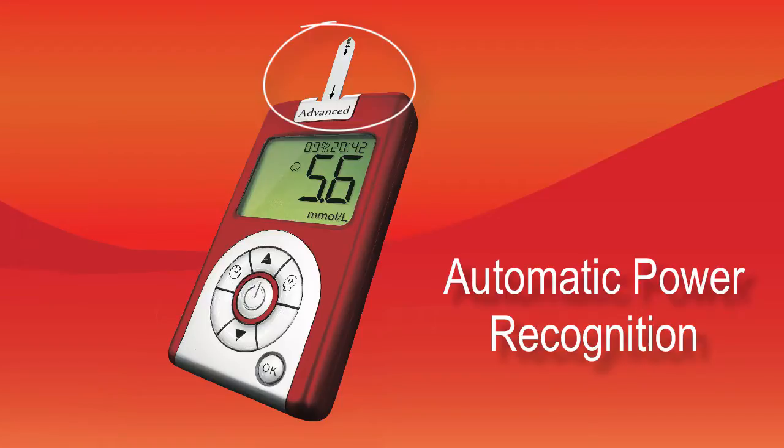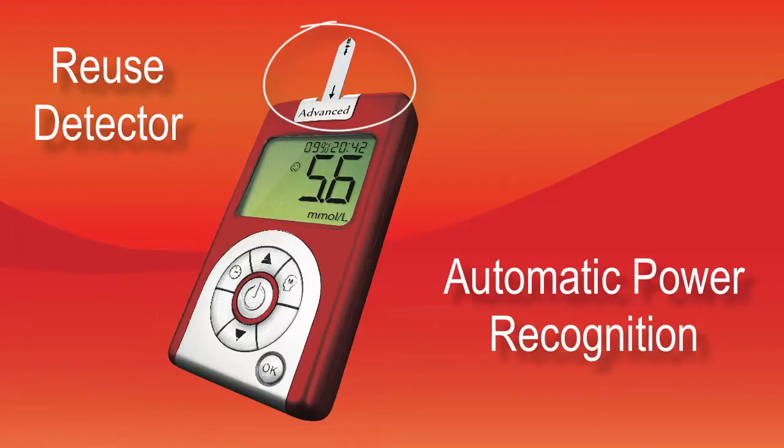The iCare Meter can also detect if you accidentally reuse a strip, to ensure actual results every time. The iCare test strips are code-free, which means you get accurate results without the extra work of entering a code into the meter. Fewer steps means fewer errors.